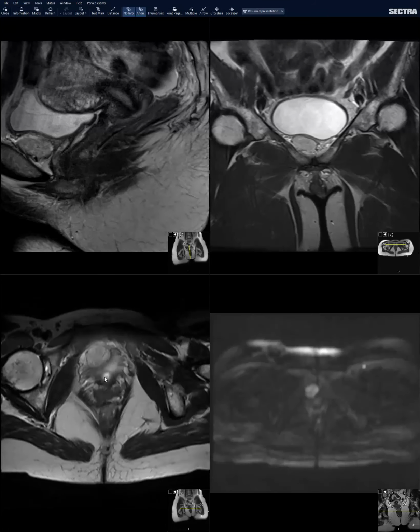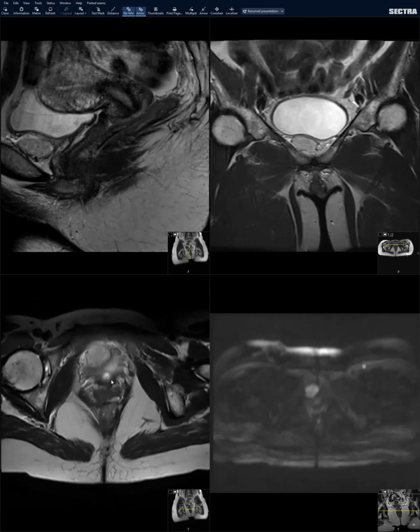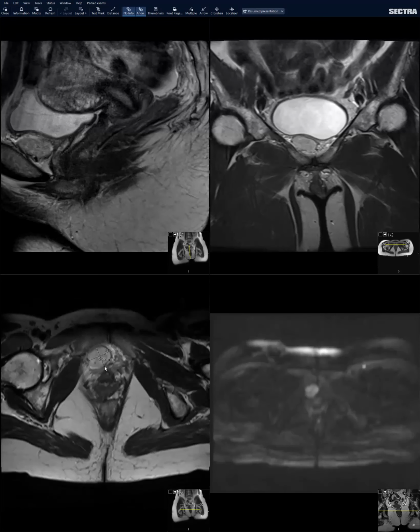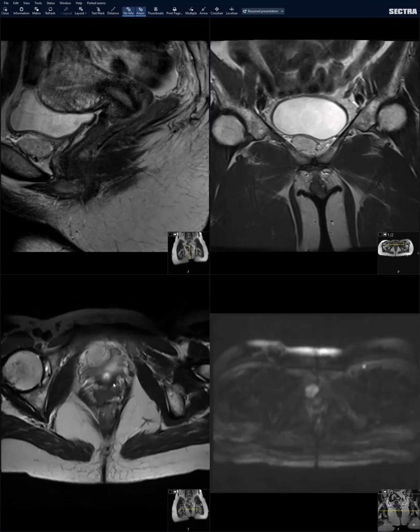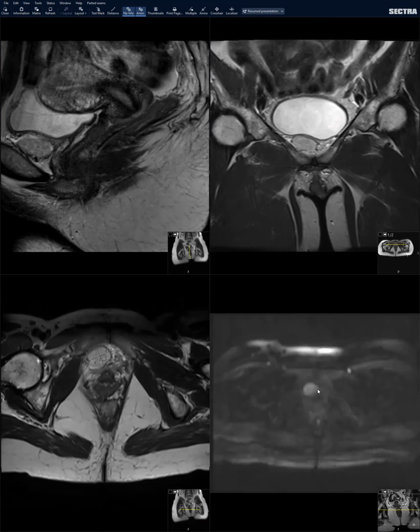We've seen a few things like foreign body granulomas to sling material or some post-surgical changes in these locations. It's kind of very retropubic. Didn't have any good history of endometriosis or anything, not that this looked typical in signal for that. No fibroids in the uterus for some weird leiomyoma type, low signal intensity, soft tissue. So this one also at pathology ended up being a solitary fibrous tumor. I think this is much more a common version of what we see with SFTs.